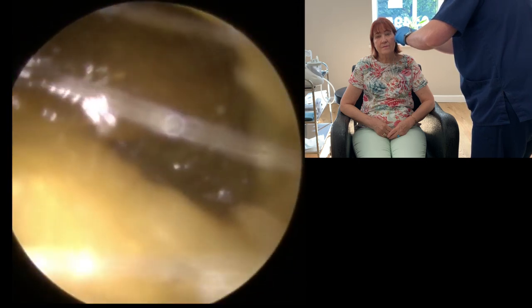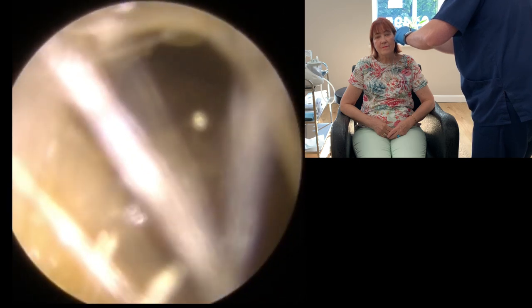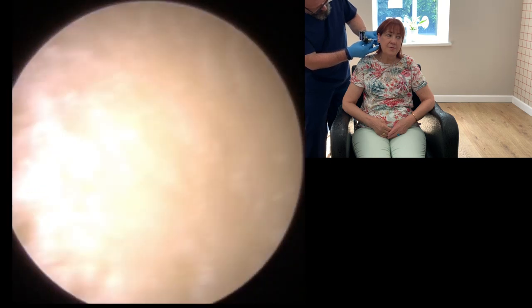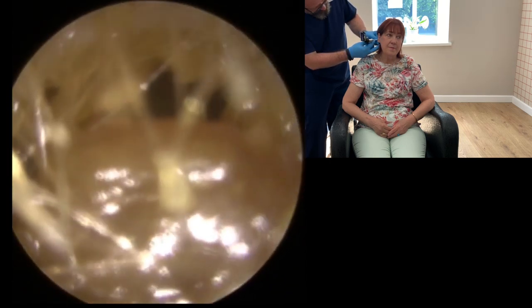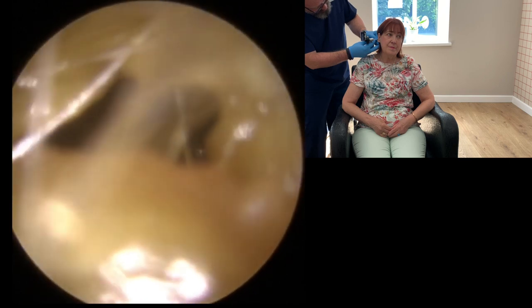Okay, so we've got a piece of wax. It looks nice and soft on the outside, sitting just inside the ear canal. It should be easy enough to remove. Let's take a look at this one as well — this is the worst one, yeah.